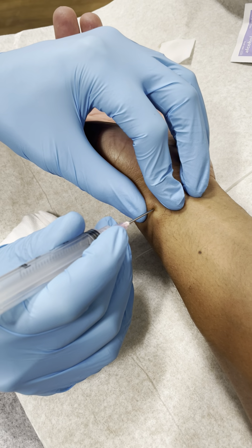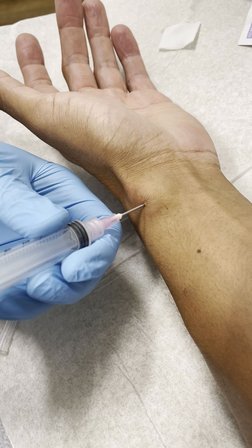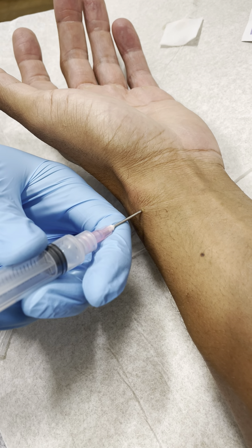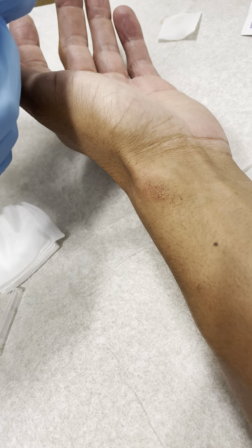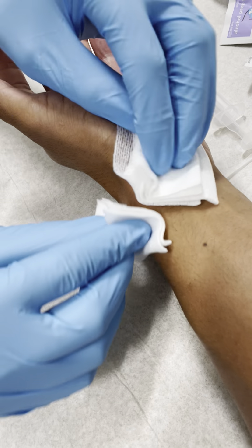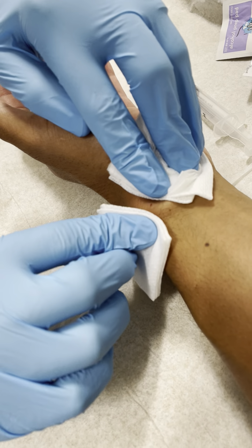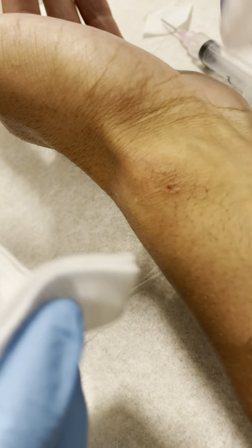We're inside of it now. I'm just going to withdraw and see if some of this fluid comes out. Then we're going to put a little pressure on it to see if there's anything else that will come out. You can see it's hard to get all of it out.